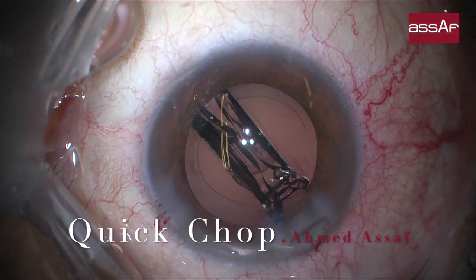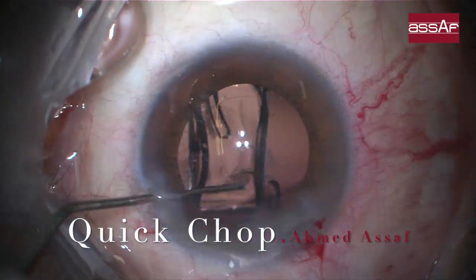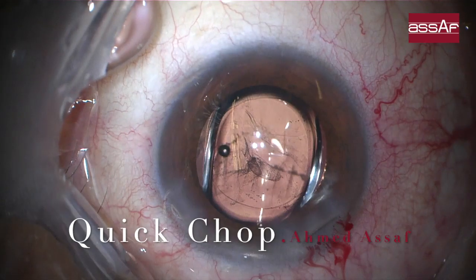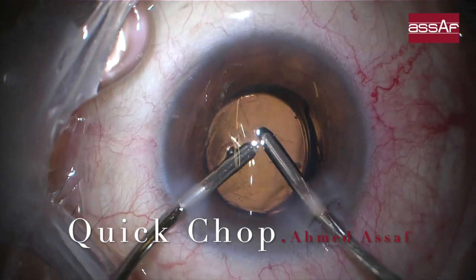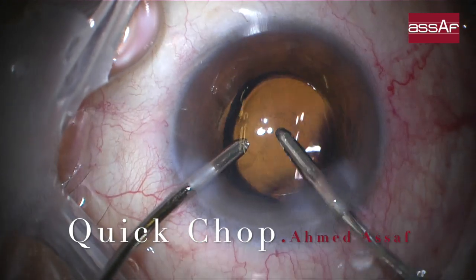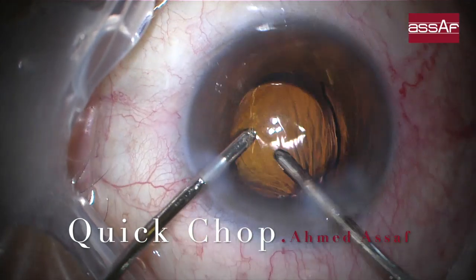The key message is that quick chop technique reduces ultrasound and is highly recommended in eyes with cornea guttata and in eyes with a mid-dilated pupil, because movement is mostly limited to the central part of the lens capsule — no need to swing widely. The nucleus is split into two halves with a minor central movement, then each half into two quadrants. Settings: high vacuum, high aspiration rate, bottle at maximum, and ultrasound in linear mode adjusted to nuclear hardness.